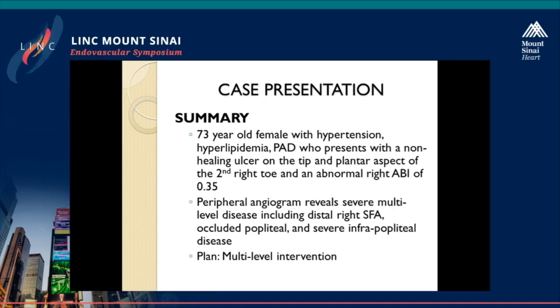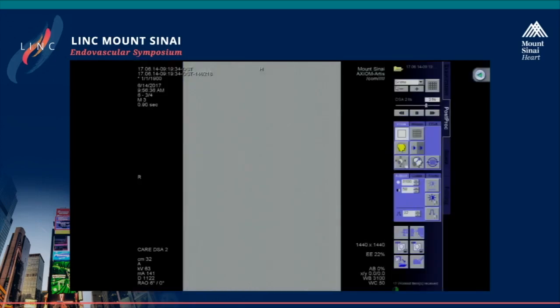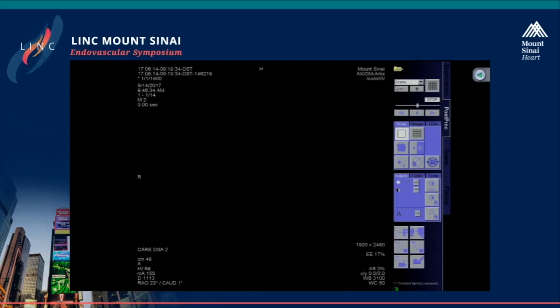So I think with this, we just wanted to show you what diagnosis we've done. So let me show you here. Sorry about this. I should have been prepared.